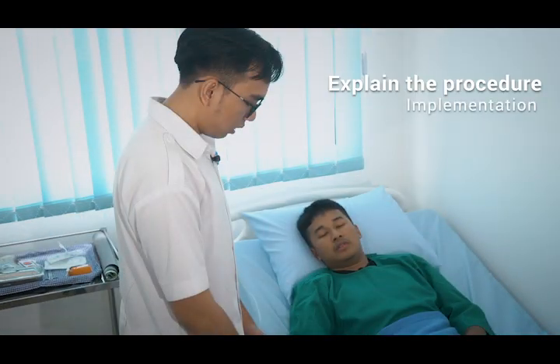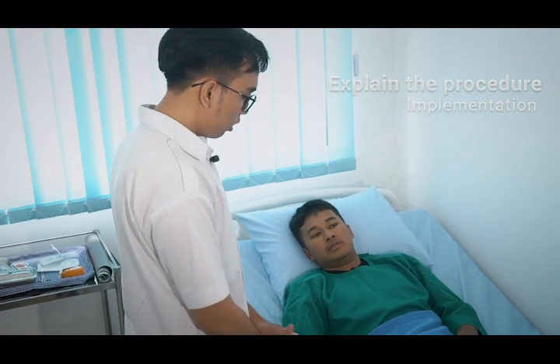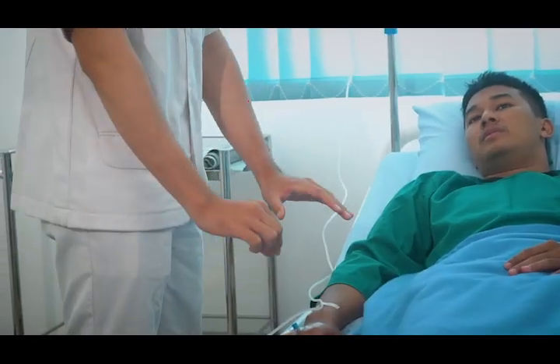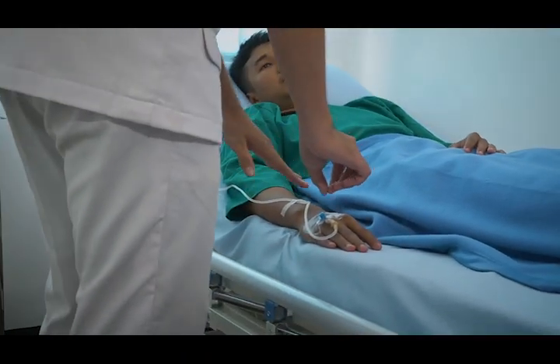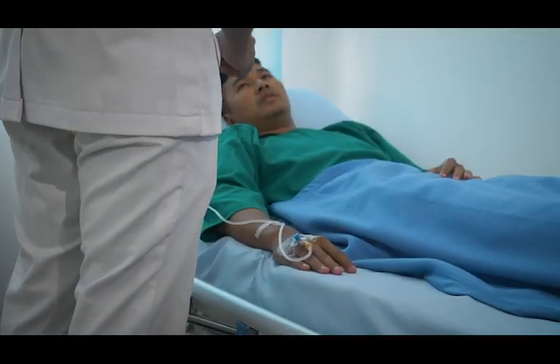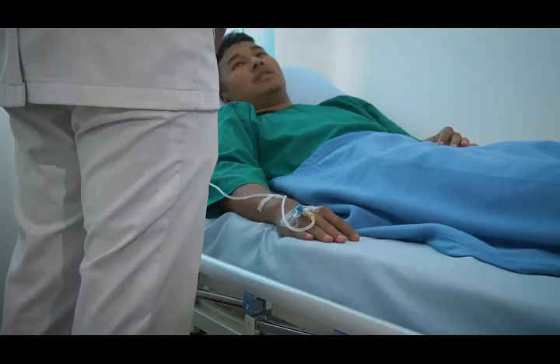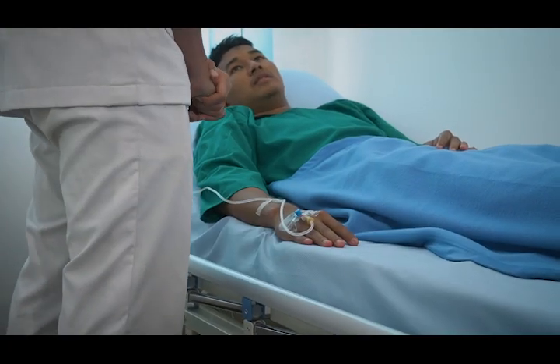Explain the procedure. So now I'll explain the procedure. I will gently remove this on your hand and withdraw the catheter. It's going to be a little bit hard because I will press your hand with the gauze. Is that okay? Okay, now let me prepare everything.